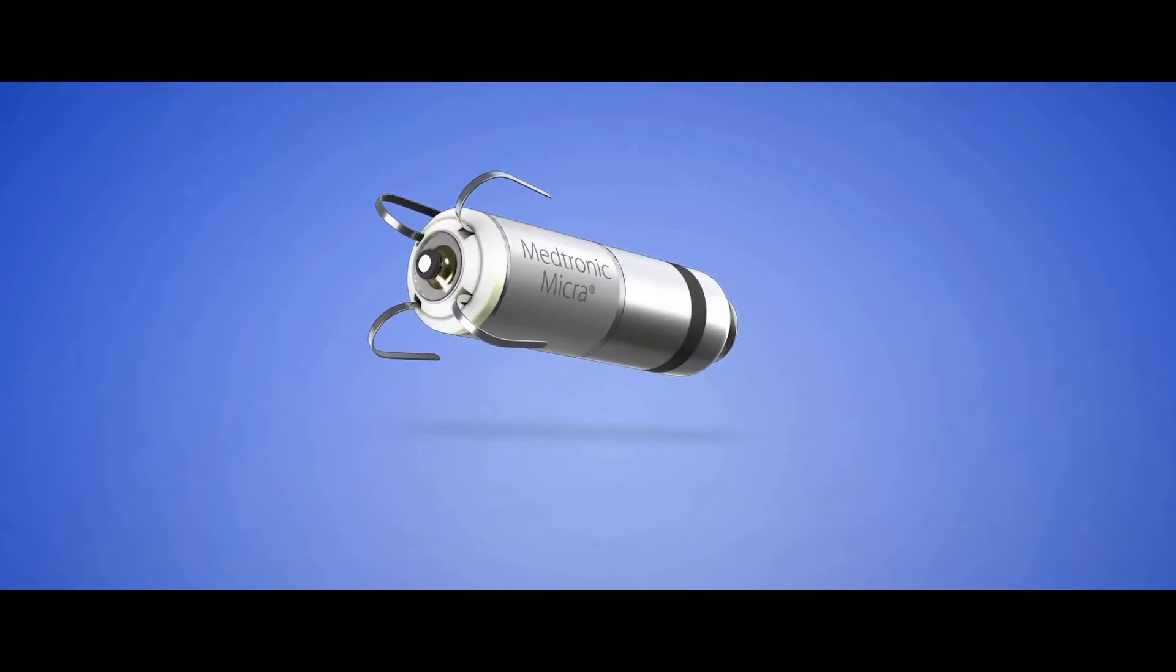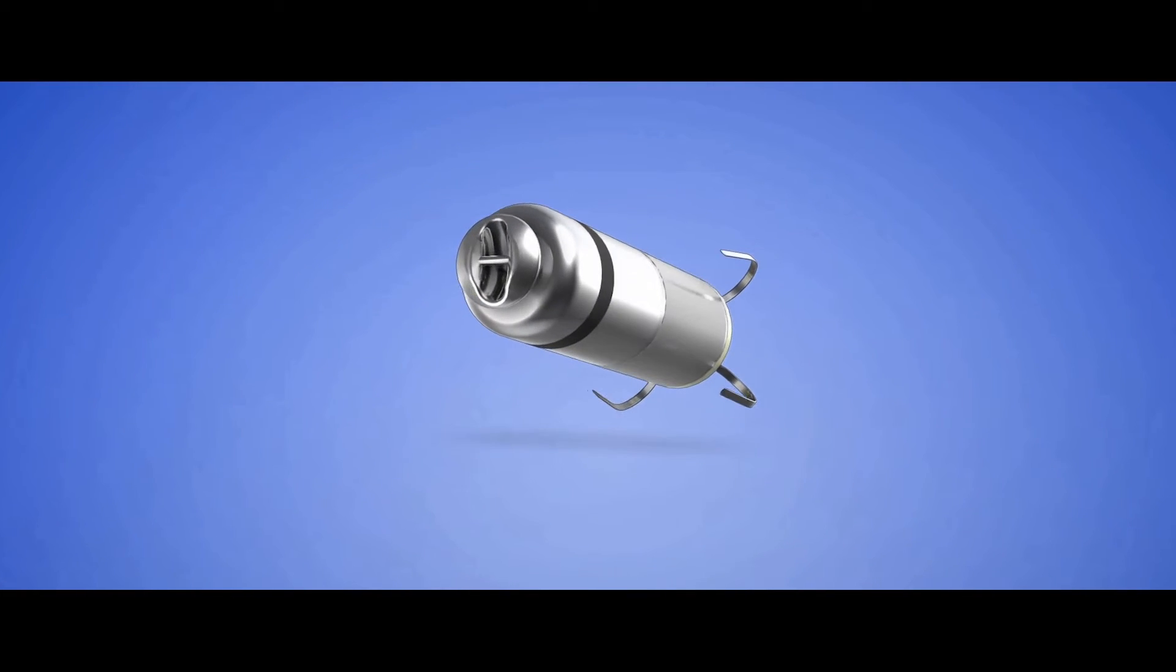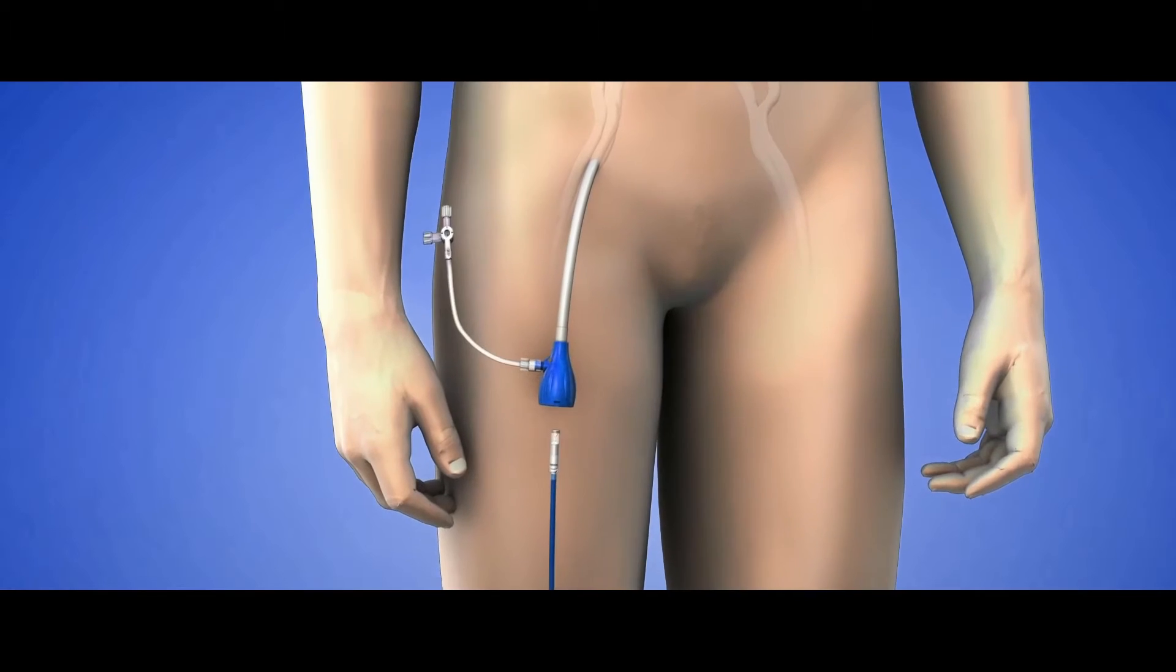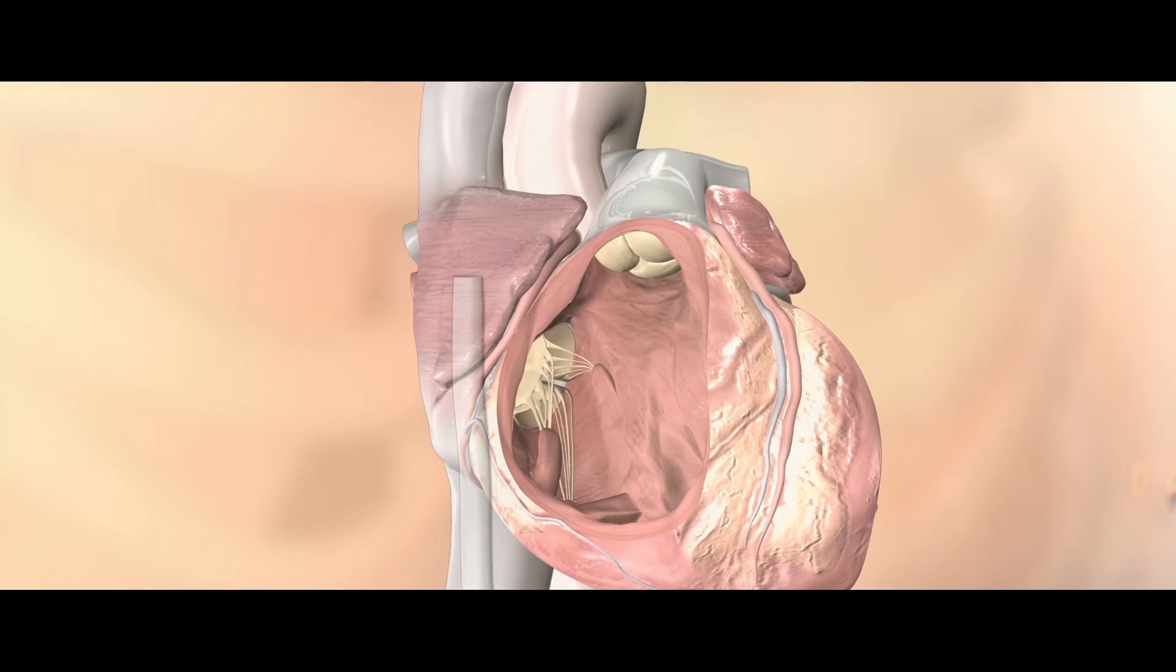The circuitry, the battery, the electrodes, and the memory are all in the pacemaker itself. With Micra, we implant in the heart, in one particular area, using catheters to deliver the pacemaker.